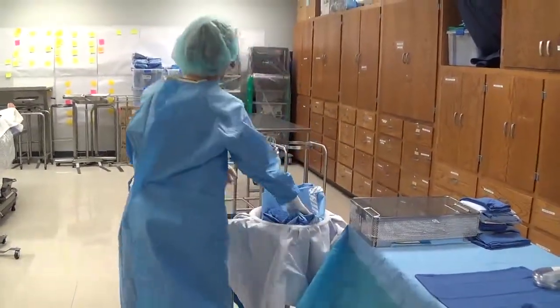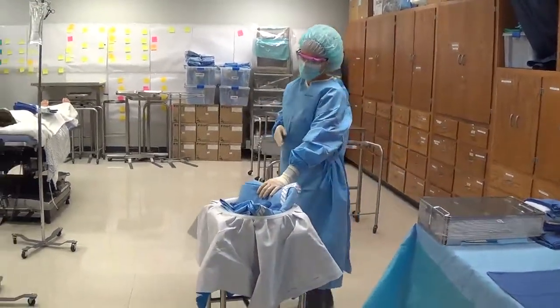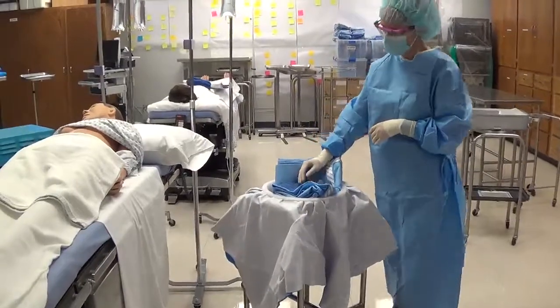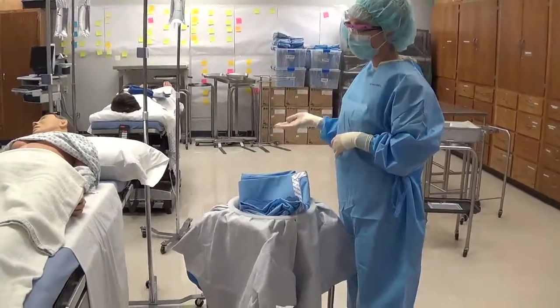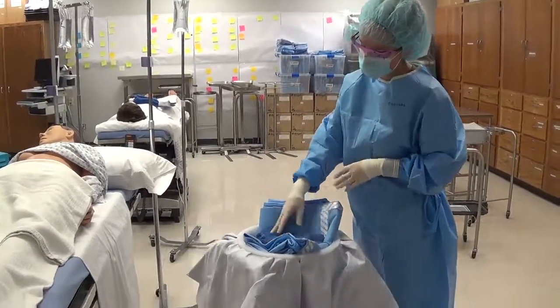If the basin is over here, come behind and approach the area where you're going to bring it up — that will help prevent that issue. You also need to be aware that you may have a cautery machine, laparoscopic tower, or something very close to you as you're bringing the basin up, so we have to watch out for those unsterile areas.